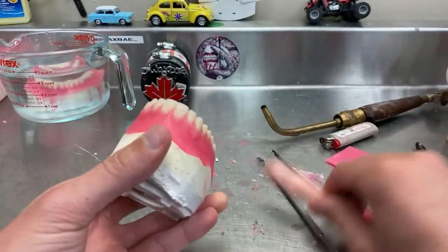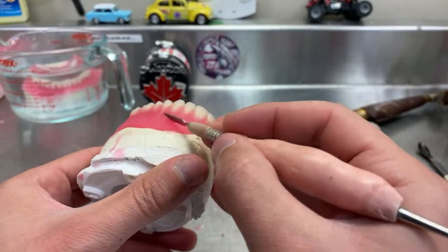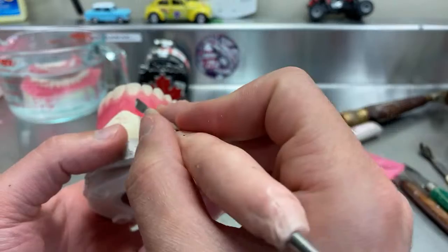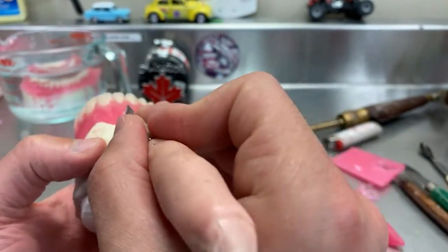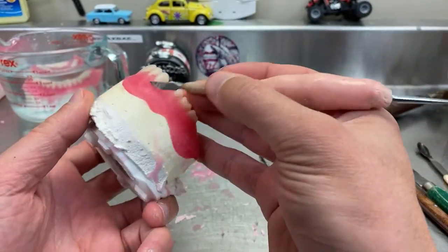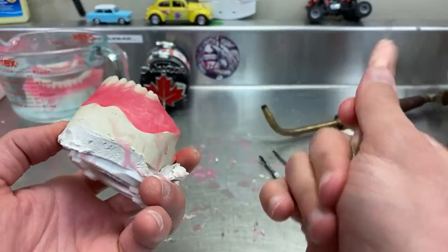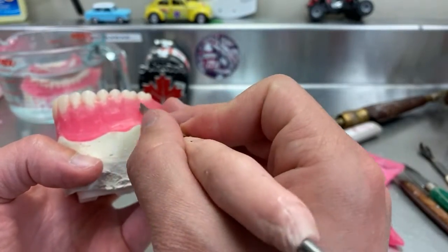That's good. So yeah, I was saying that you need to get rid of any big marks from the carver or whatever, because that will actually cause problems. So you go like this, just go feel it around. If there's anything catching your carver, because once you flame it, all of these details will actually pop.